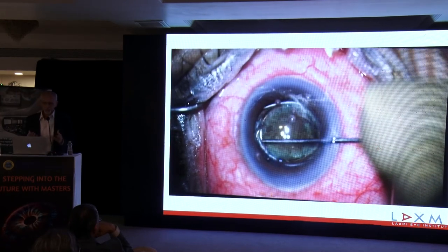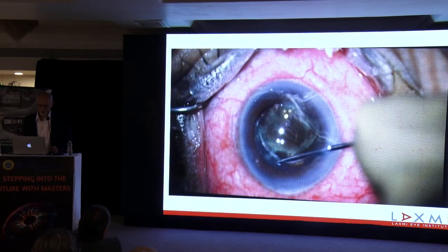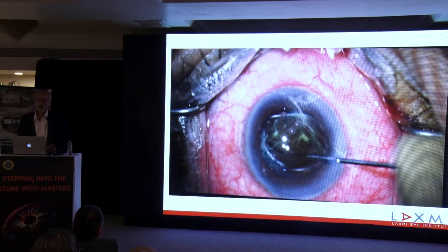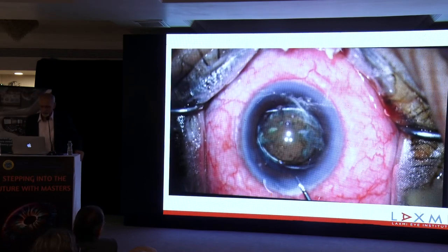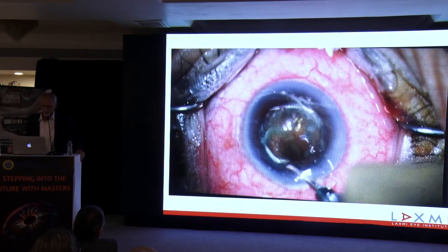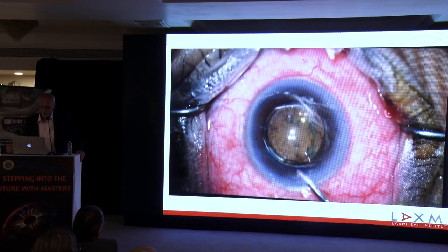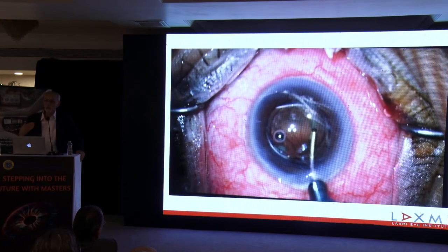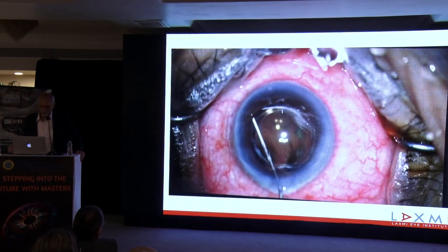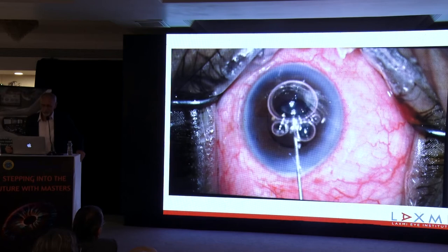And once I reach under the lens, because if you want to get the lens out, you have to separate it from all around, that's when I realized that what I thought all along as silicone oil deposits on the lens doesn't seem to be that, but just the emulsified silicone oil which is stored in the capsule. And this has not happened immediately after the silicone oil removal. It has taken some time, because the patient was seeing well for some time after it. So this is quite confusing, as to where this silicone came from, and why the patient persistently has high pressures as well.